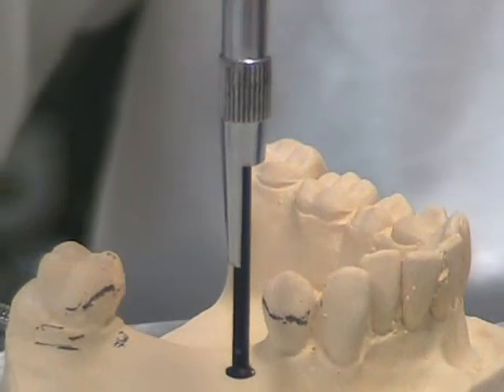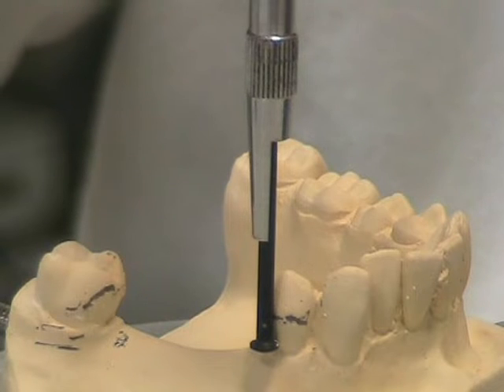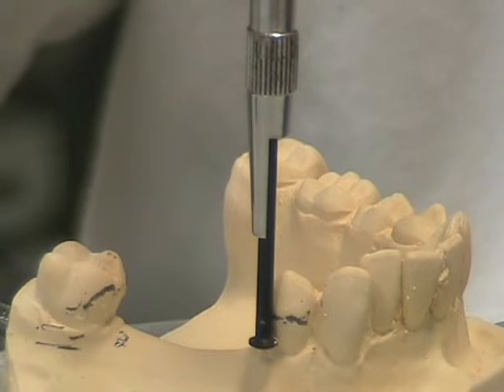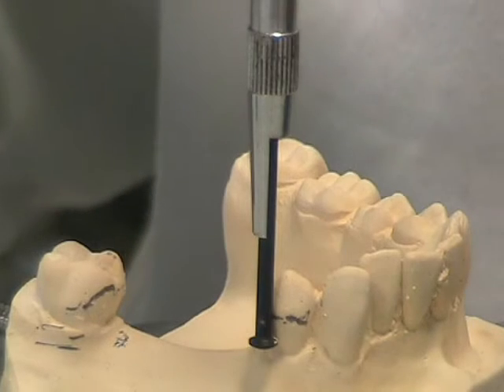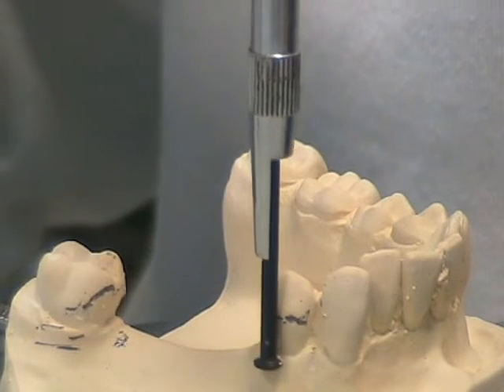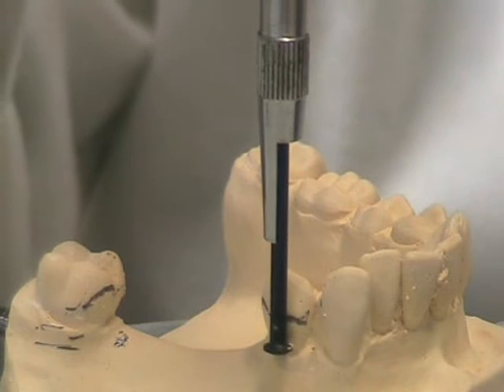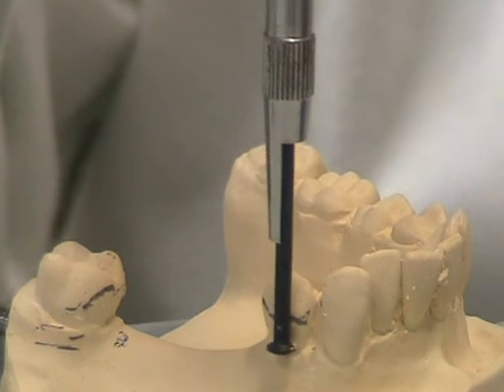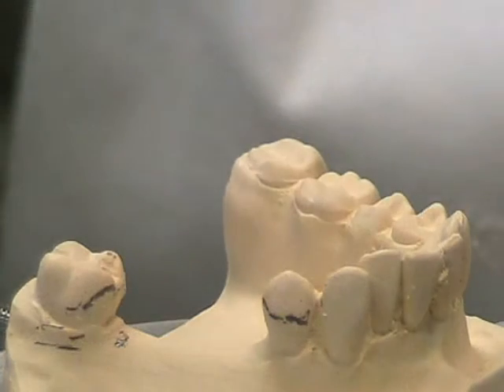The undercut gauge is placed next to the tooth. It is pulled up slightly until both the stem and the lip are touching the tooth at the same time. Once this position is found, the undercut gauge is moved left to right to make a small scratch into the cast.